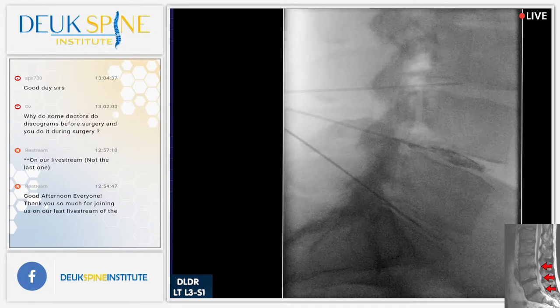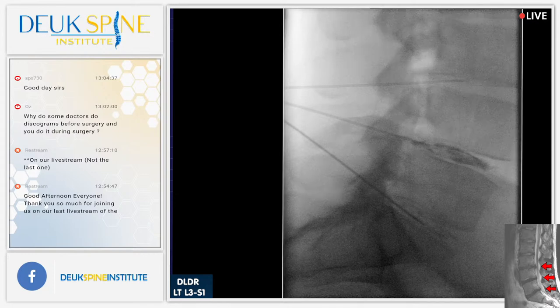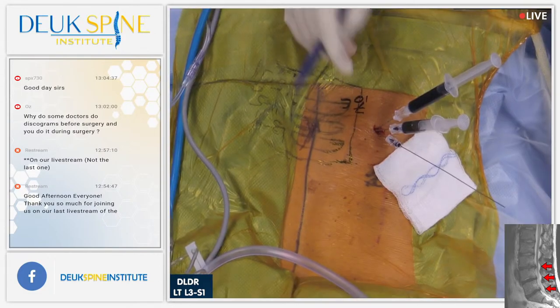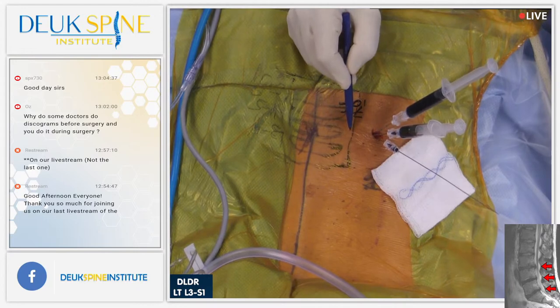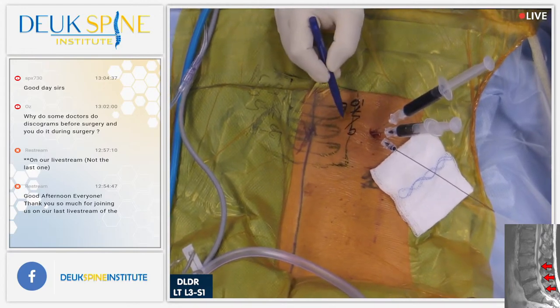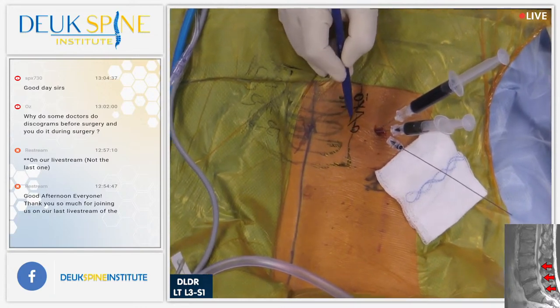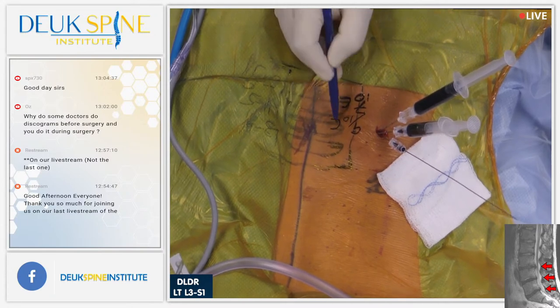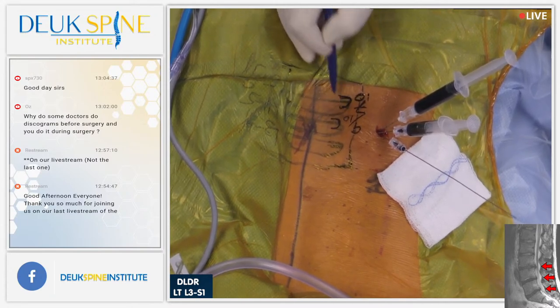How bad is that on a scale of 1 to 10? Sounds like it's higher than a 7. What's the highest it goes? He's funny. He said 7, but he kept going like, grrr. I'm like, really? 7? I don't know, but all I know is I want the wiggling to stop. I'm just trying to give you ideas. So that was a 9 over 10. Concordant? Yes. I'm sorry about that, my friend, but we're just confirming the right disc.